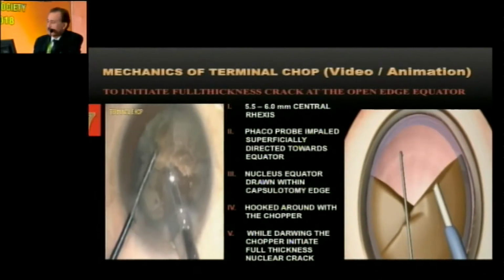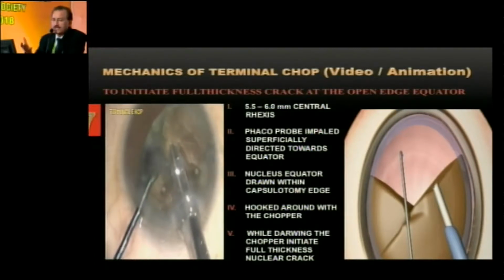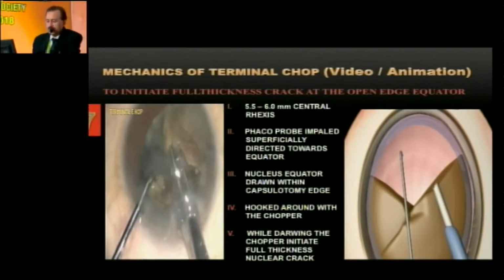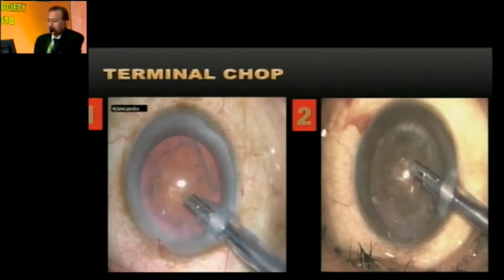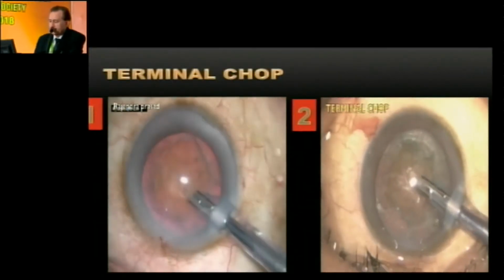You crack the hard cataract, and once you crack the hard nucleus, then you can very simply draw them and emulsify very simply. You can see these two videos simultaneously here. So I'm showing both of them together.